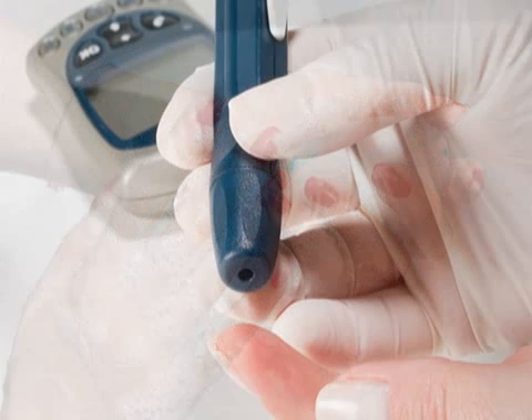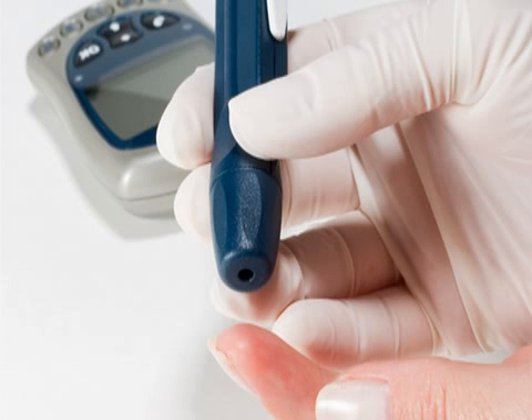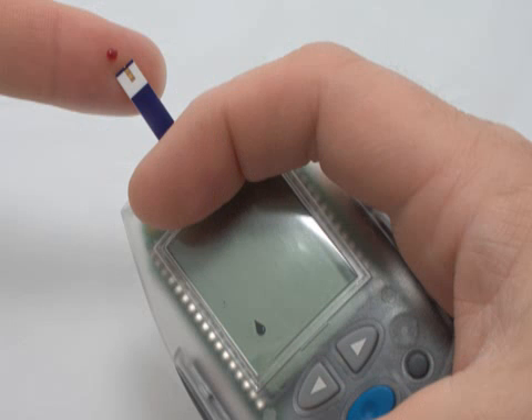To monitor glucose, sanitize your hands and then prick your finger with the spring-loaded needle included with your meter. Finish by squeezing a drop of blood onto the meter and reading the results.